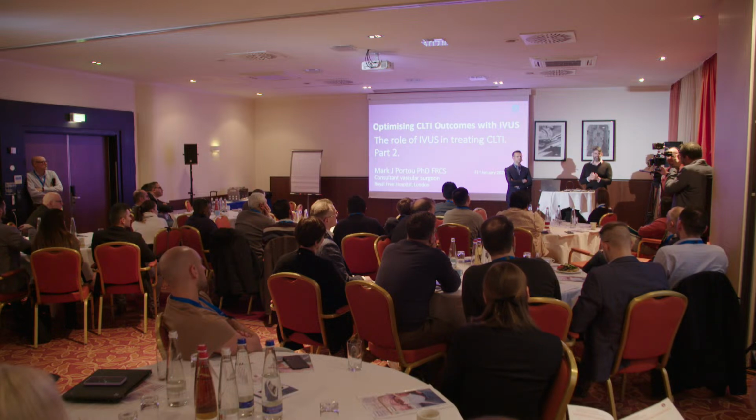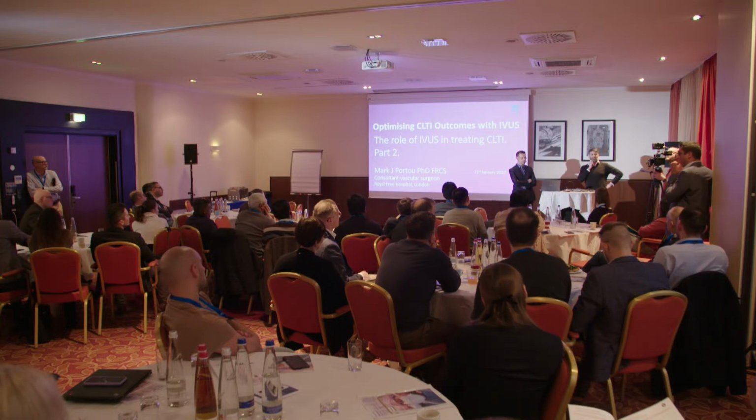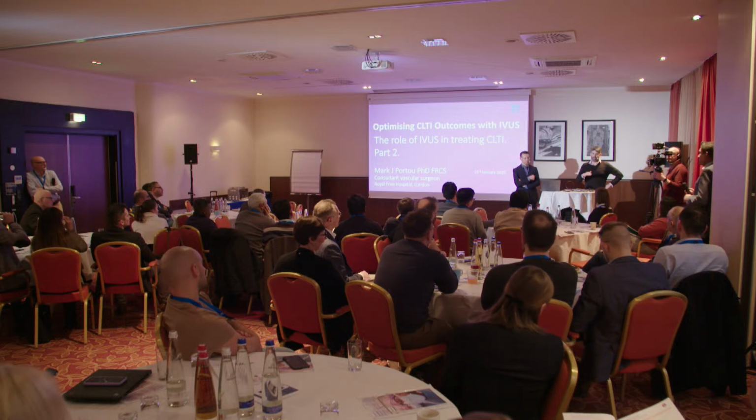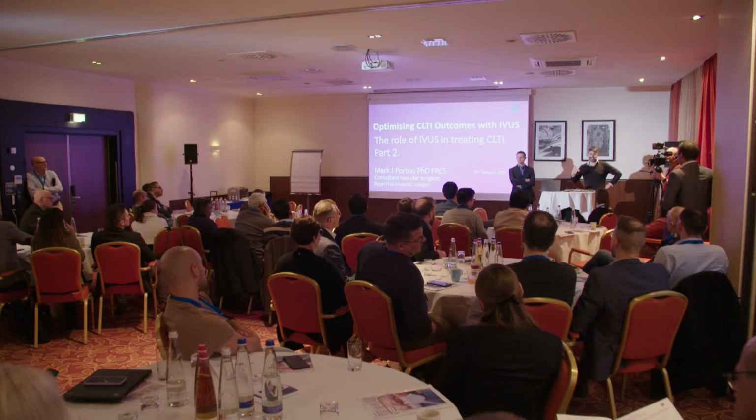So now with IVUS, because I'm doing less of the angiogram, think, look around the room, look at the clock, look at the foot, look back at the angiogram, and make a decision. I've pretty much made the decisions about what we're going to do as first-line treatment and what the bailouts are going to be if each of those treatments are not successful from the first IVUS pullback, and then the speed really goes up.